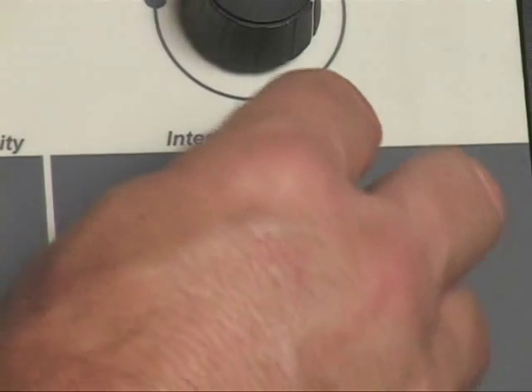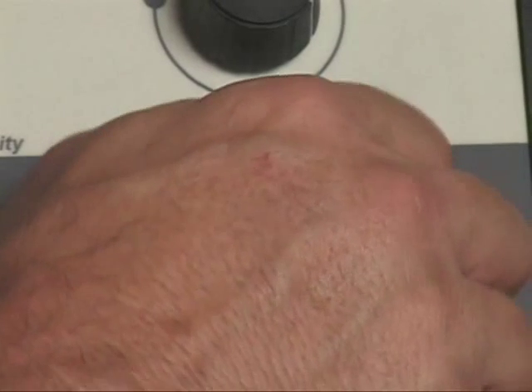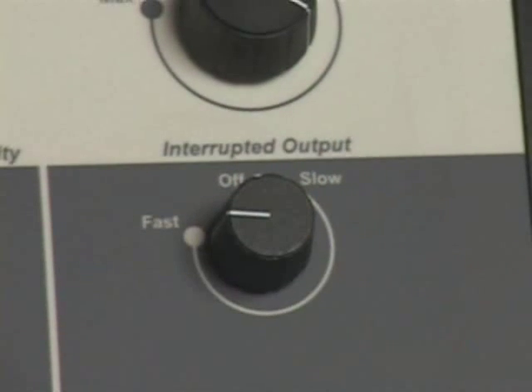Interrupted ultrasound output can be achieved by rotating the interrupted output control clockwise, enabling the audible click, and setting the interrupted output control to the desired output interval.